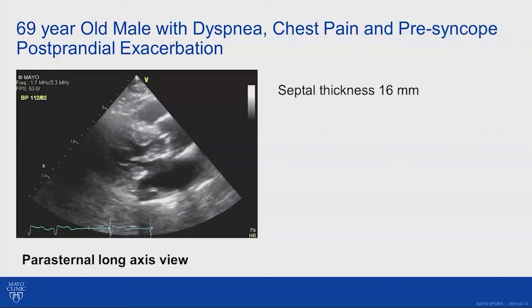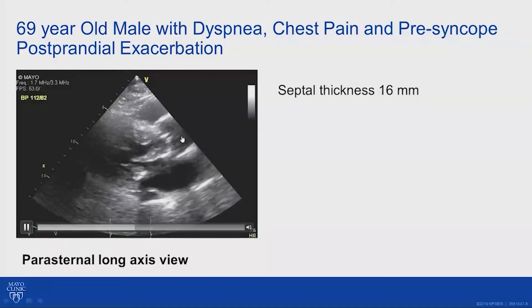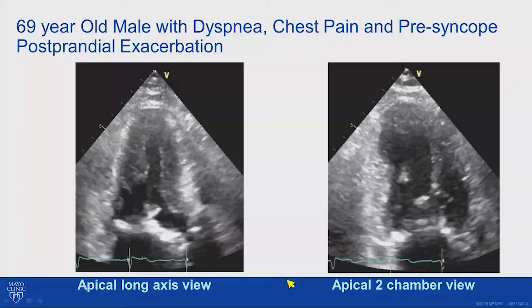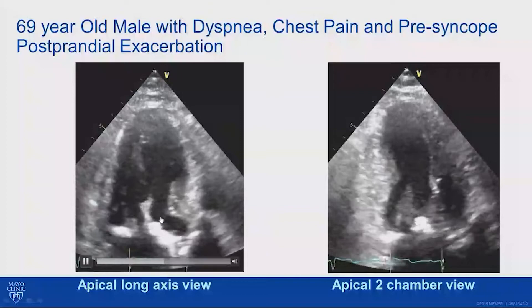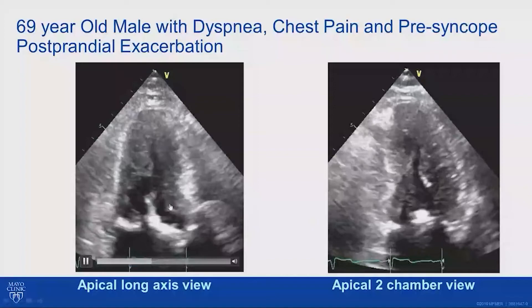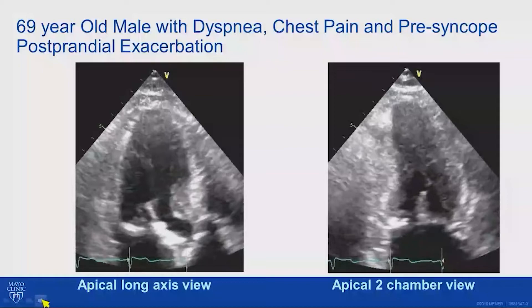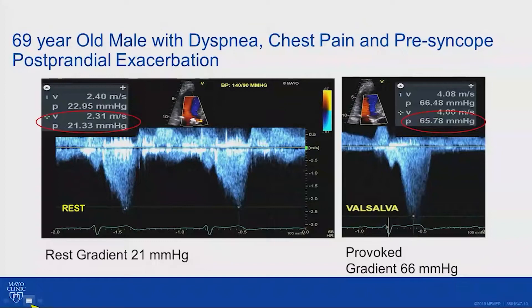His echocardiogram parasternal long axis view shows thick walls. He has calcium in his mitral and aortic annulus, a narrowed outflow tract, and an aberrant muscle bundle underneath the septum. His wall measured 16 millimeters. In the apical long axis view, he has significant systolic anterior motion, significant mitral annular calcification, and minimal mitral or aortic stenosis. In the two-chamber view, he has thick walls all the way around his heart, though the septum is more thick — asymmetric septal hypertrophy. At rest he has a gradient of 21, and with Valsalva it went up to 66 mmHg.